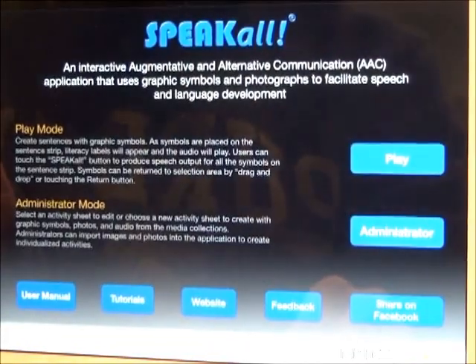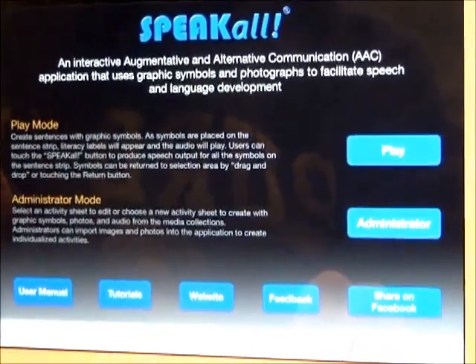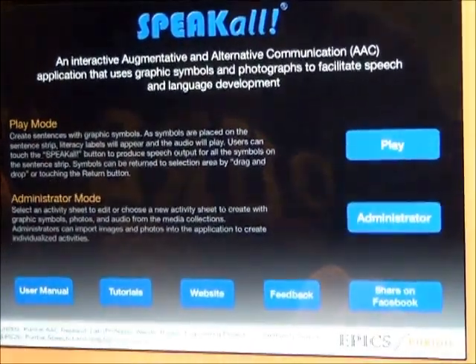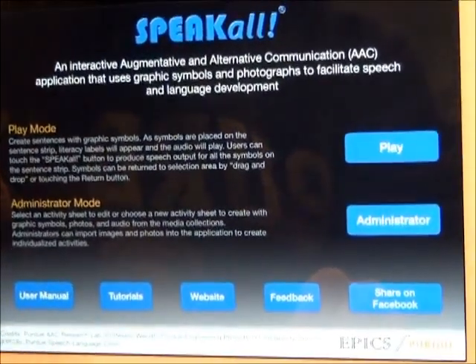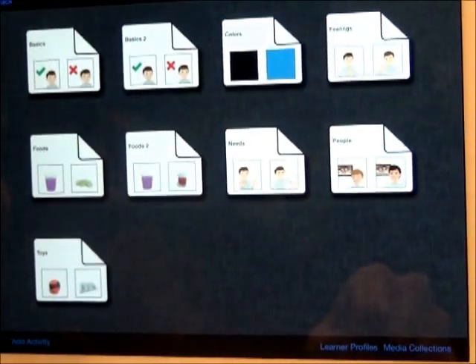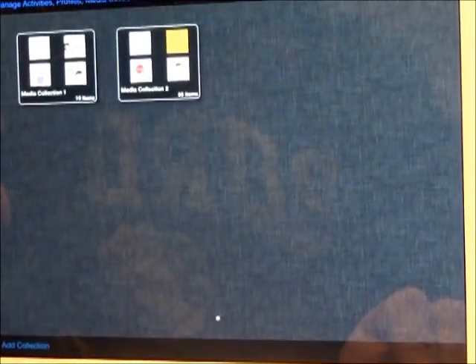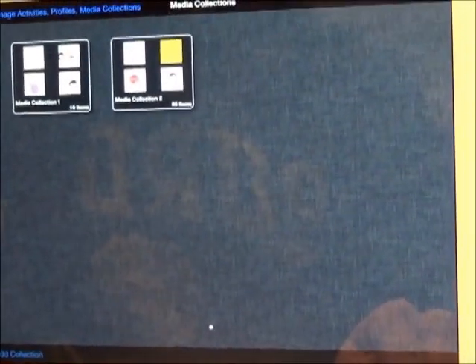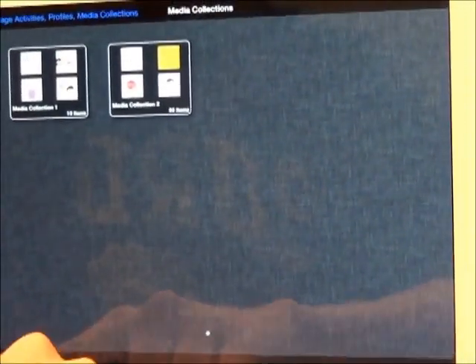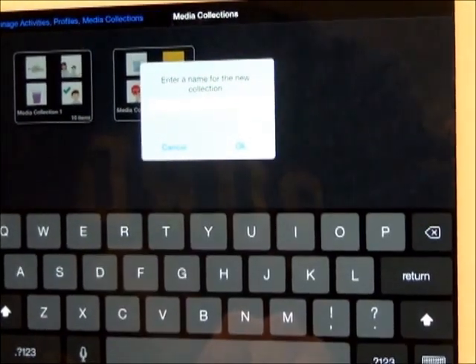Now I will show you how to manage media collections. To enter media collections from the home page, select the Administrator button. Then, in the bottom right-hand corner, select Media Collections. To add a media collection, select Add Collection. Enter a name for the new media collection.